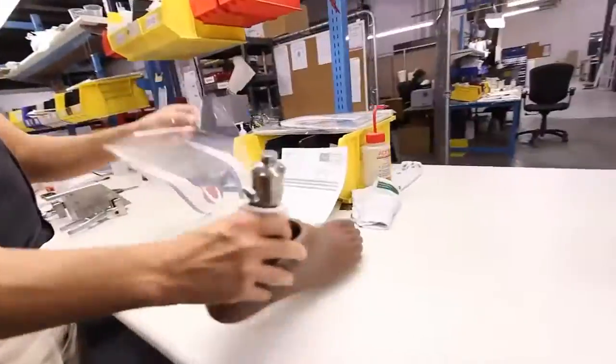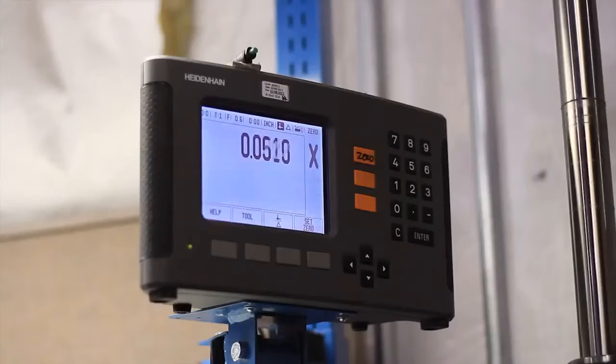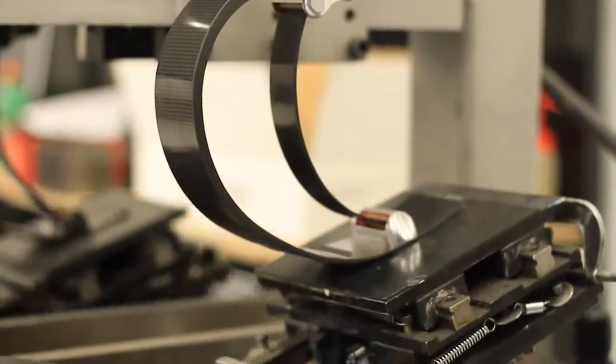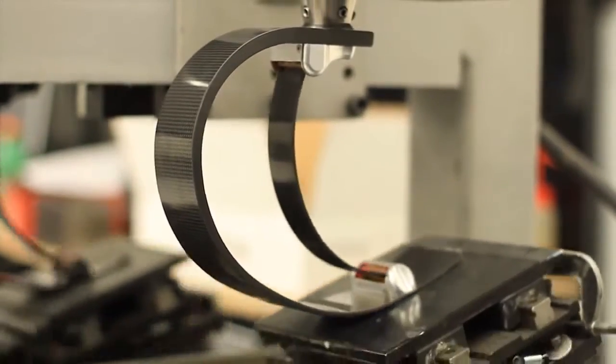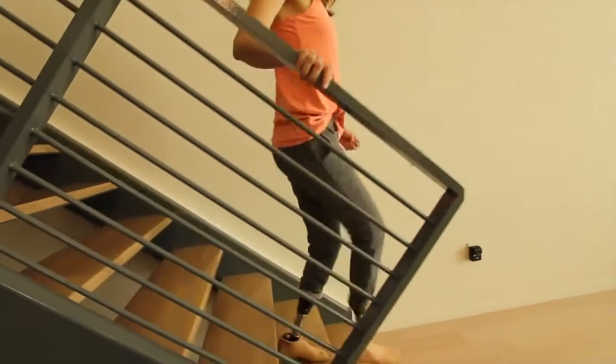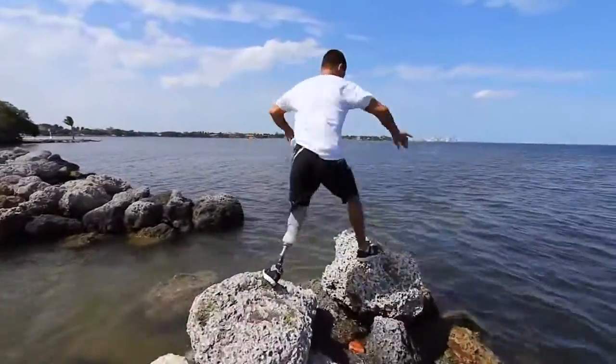And finally, when a Freedom Innovations prosthetic foot product comes out of the manufacturing process, it's tested, tested, and tested again to make sure that it will perform as expected. The ultimate goal is to produce carbon fiber foot products that give amputees the very best modern technology has to offer, so they're free to live more active, healthy lives.